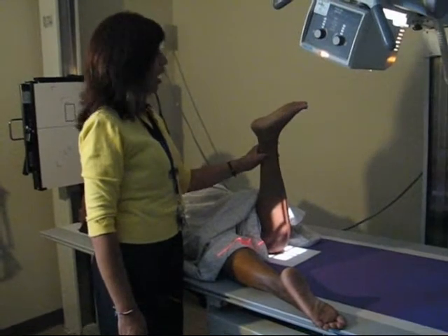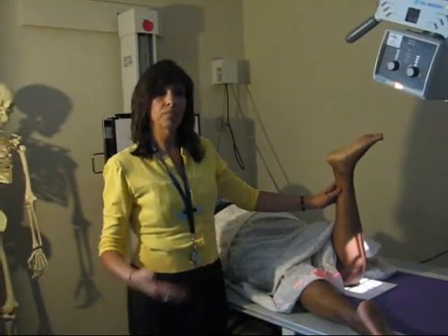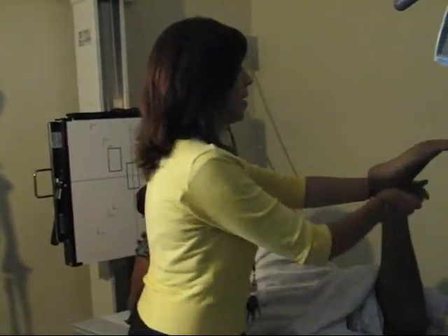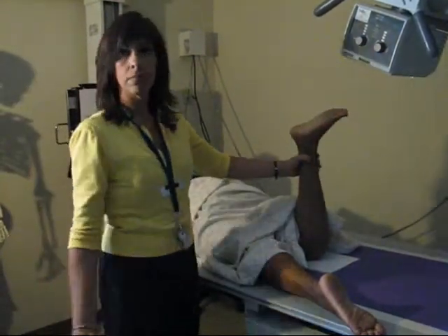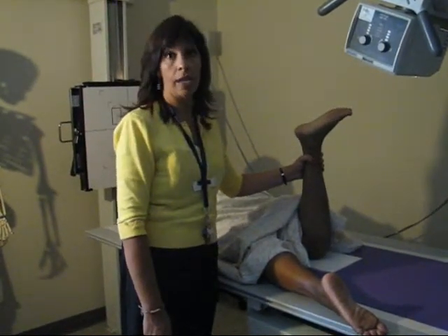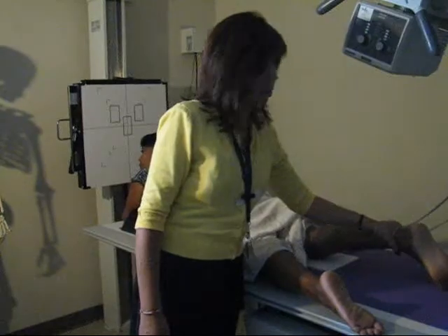If your patient cannot hold their leg in this position, you can use a belt or a strap of some kind, just like we did before for the calcaneus, and wrap it around here and come over her shoulder and have her hold it, in case for some reason, due to pain or other limitations, she could not hold her knee flexed this way. And that's your sunrise, one of your sunrise projections.